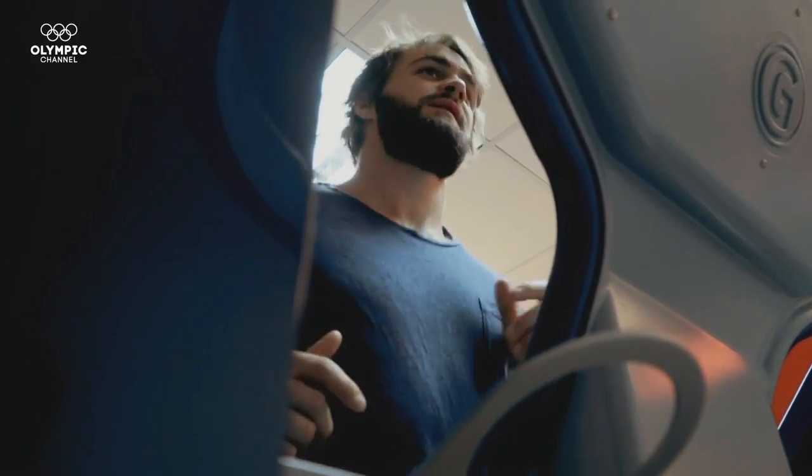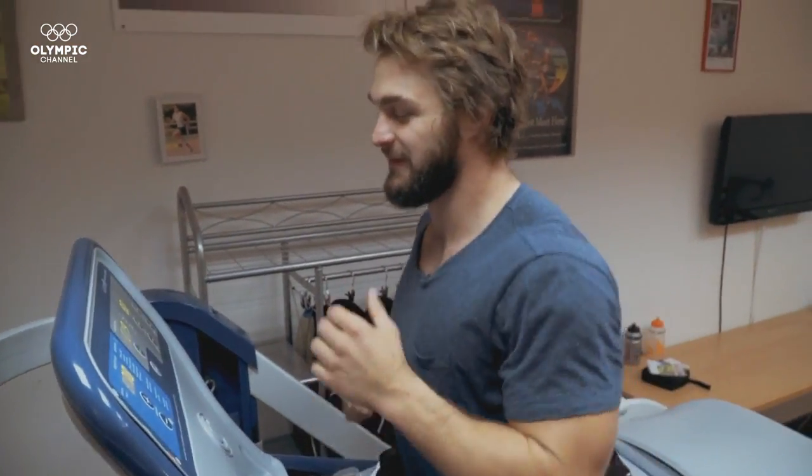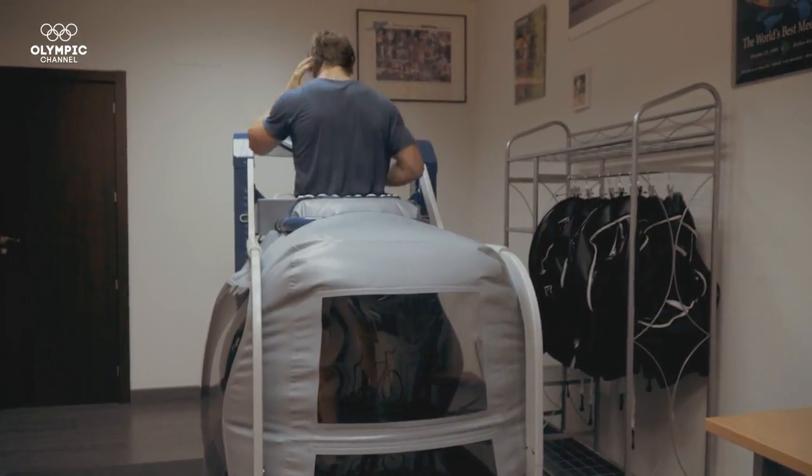I'm used to training at quite high volumes and intensities, and because of the injury that I've picked up, I obviously can't maintain those levels. So what the treadmill allows me to do is to keep training at quite high volumes and intensities, but still helping me recover. It's completely aware of my limitations and my needs, and it means that I can still maintain my physical form.